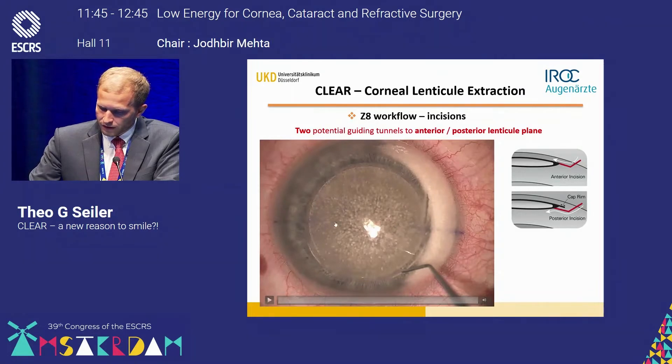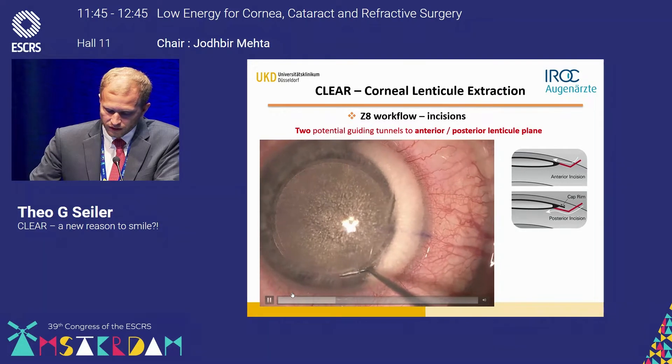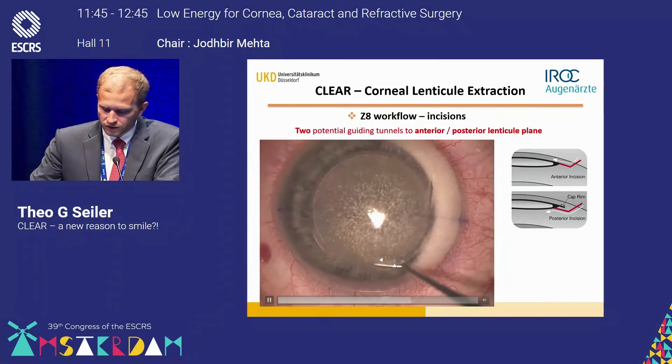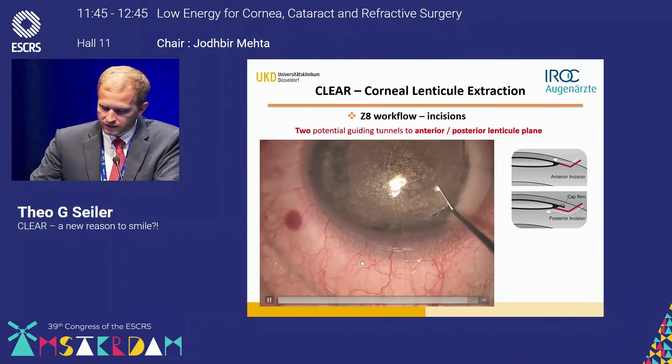Here is a video showing how to distinguish whether you are anterior or posterior to the lenticule. I'm using only one incision in this video, with the other as a backup in case I get lost — though this only happened in the first two patients. You'll see I go into the incision, turn the hook, confirm I'm anterior to the lenticule because there's no reflex of the lenticule margin, and then open it up to get an entrance for dissection.